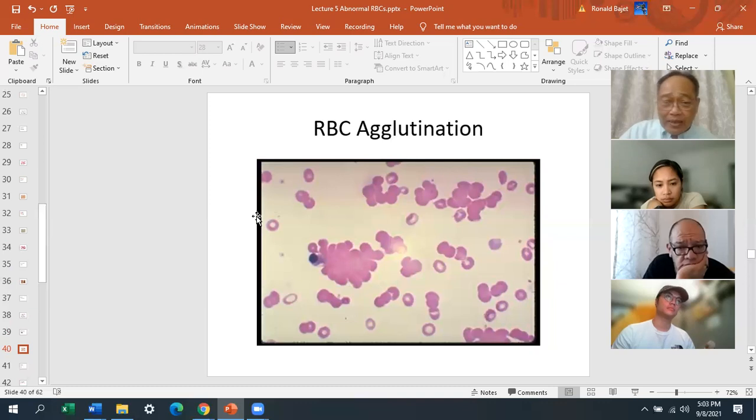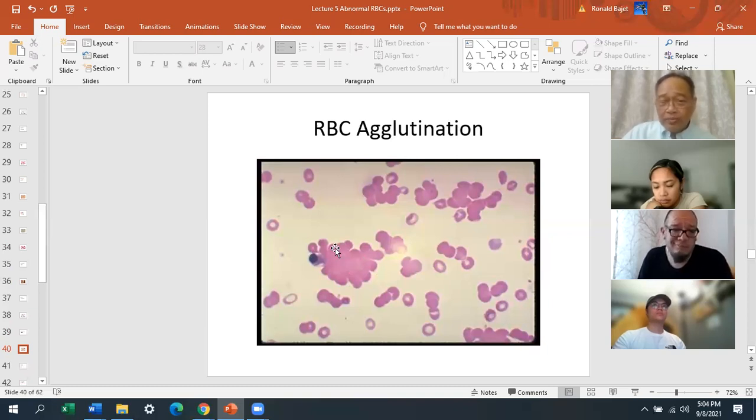So here, what's the normal value for this red blood cell? It's 80 to 100, right? You think this is 80 to 100 when it goes through the flow cell? No, you're going to get a super sky high MCV, and that's what your instrument's going to read. Even though they're stuck together, when you run this through the analyzer, it's going to read it the same way it reads this red blood cell or this red blood cell. The normal for that one is 80 to 100. This is not 80 to 100. You're going to get an incredibly high MCV. So just keep that in mind.